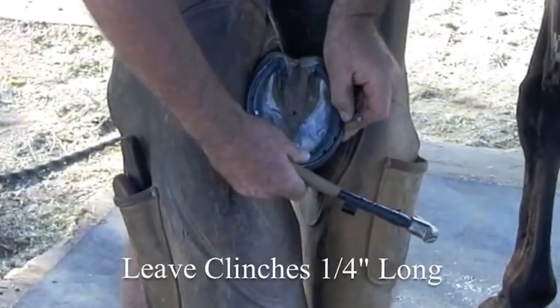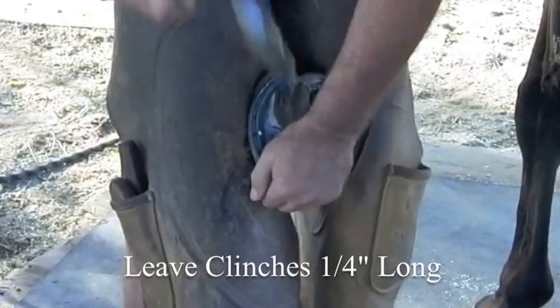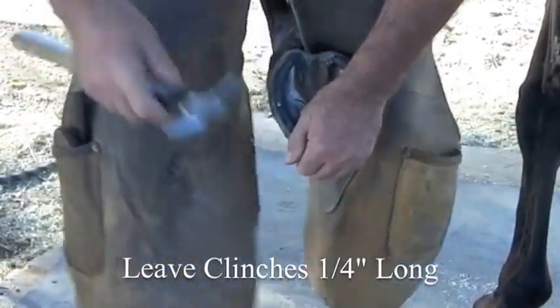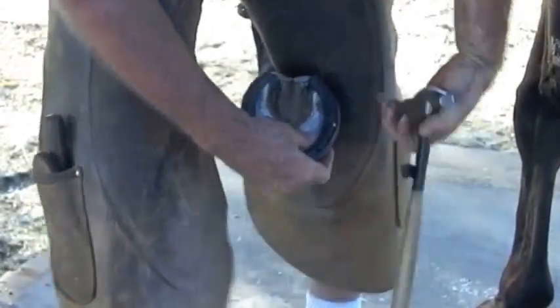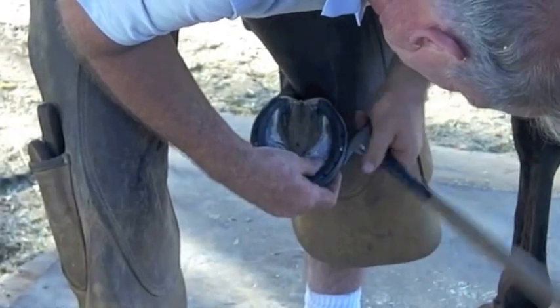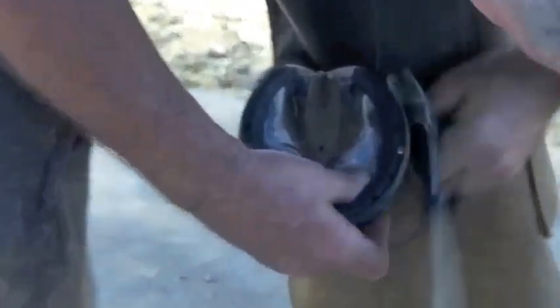Here I'm driving nails both in the heel area and the toe area. Try to drive a high nail and leave the clinches about a quarter of an inch long, leaving them at 90 degrees — perpendicular — to the hoof wall. These will act as anchors for the casting process.